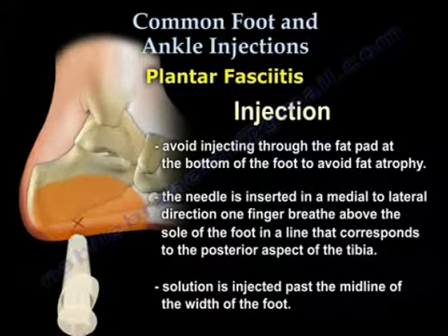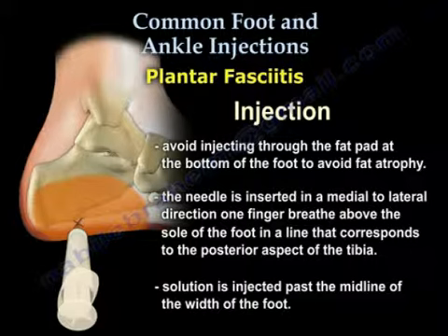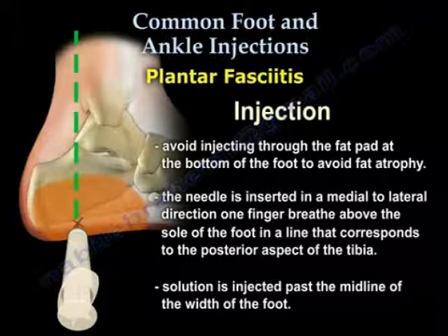The needle is inserted in a medial to lateral direction, 1 finger breadth above the sole of the foot in a line that corresponds to the posterior aspect of the tibia. The solution is injected past the midline of the width of the foot.